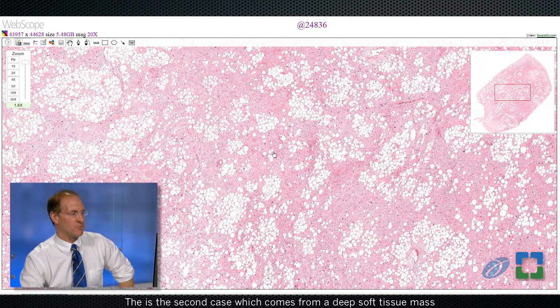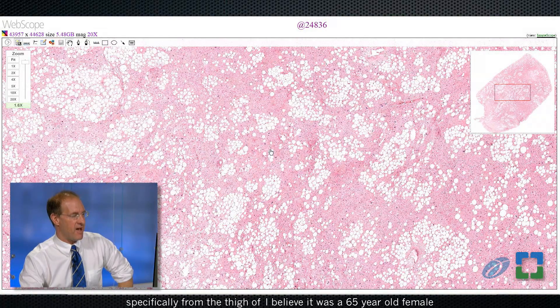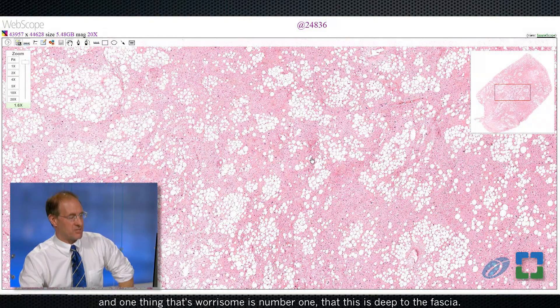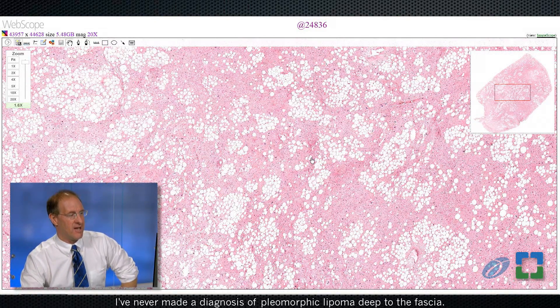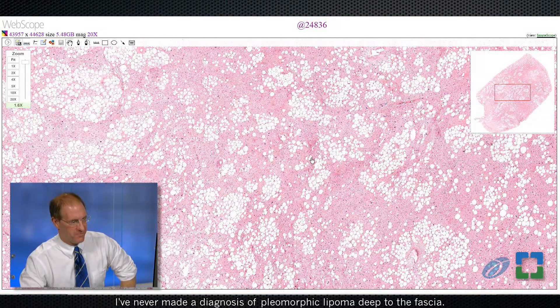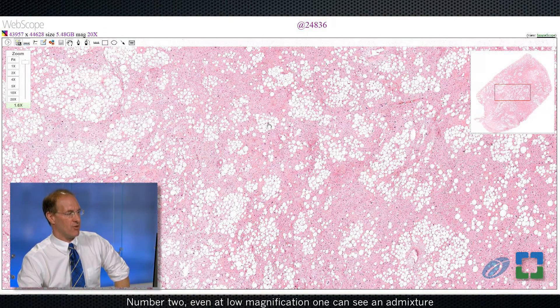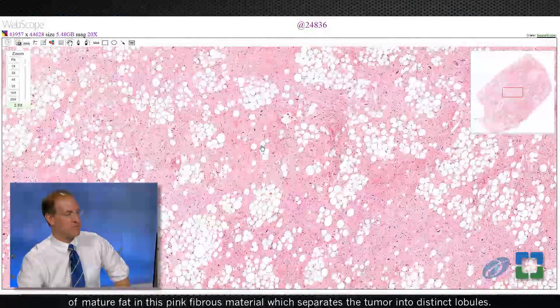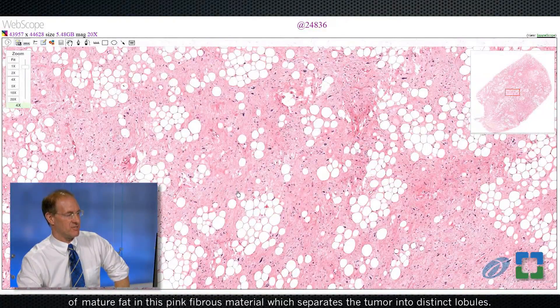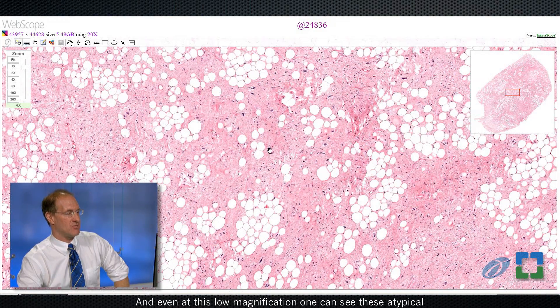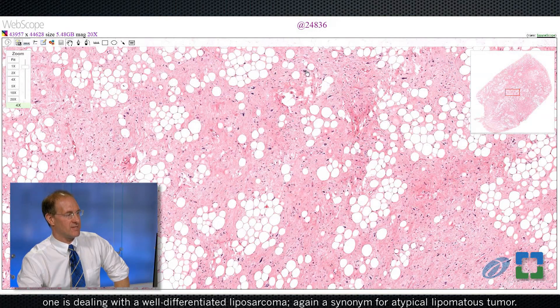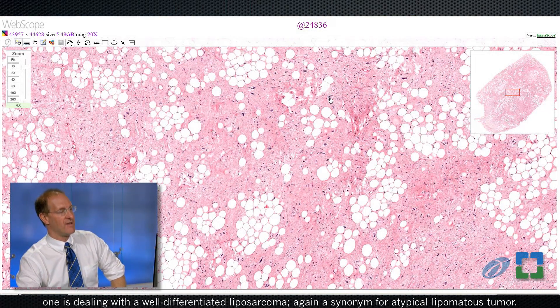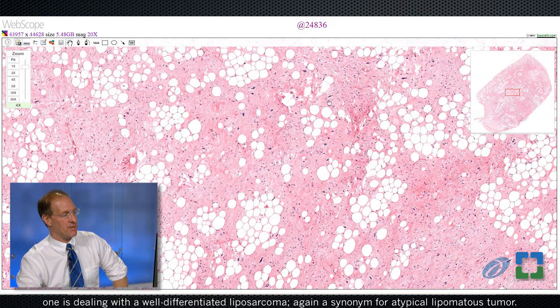The second case comes from a deep soft tissue mass, specifically from the thigh of a 65-year-old female. What's worrisome is, number one, that this is deep to the fascia — I've never made a diagnosis of pleomorphic lipoma deep to the fascia. Number two, even at low magnification, one can see an admixture of mature fat and pink fibrous material that separates the tumor into distinct lobules, and one can see atypical hyperchromatic nuclei indicative of a well-differentiated liposarcoma — again, a synonym for atypical lipomatous tumor.